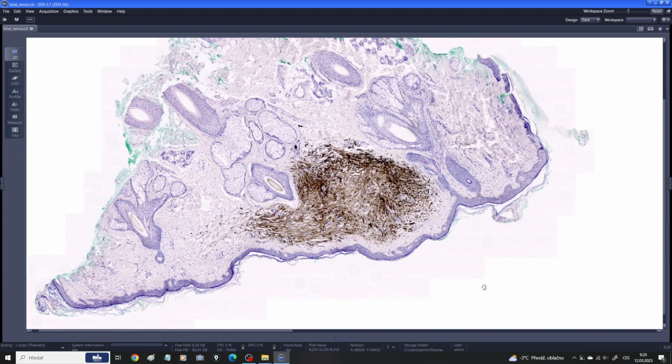It is less common, but it is definitely not rare, and you will see it. The blue nevus, very often you can see it in children or adolescents, very often on the face, hands, feet, or buttocks. And why do we call it a blue nevus? It's because macroscopically, grossly, the nevus is blue. It's more bluish. It is not black or brown. So the blue nevus is basically a macroscopic descriptive term. It describes the gross color of the lesion.